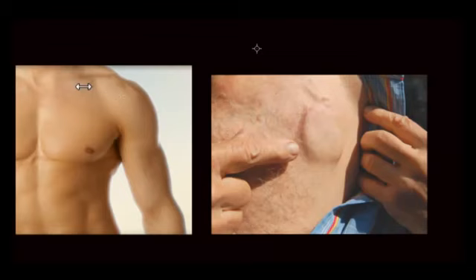Through the sheath, various pacemaker electrodes like the ones shown in the previous slide are inserted and positioned in the right atrium and the right ventricular apex. Once these electrodes are placed, they are tested to make sure that the position is good and the electrode is able to identify the electrical impulses coming from the heart and also pace the ventricle so that the ventricular muscles can contract.